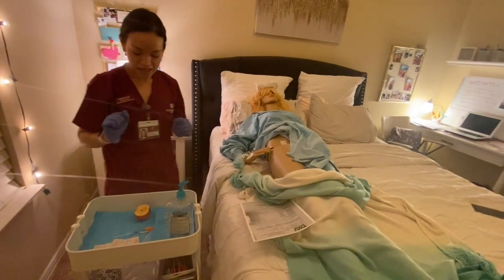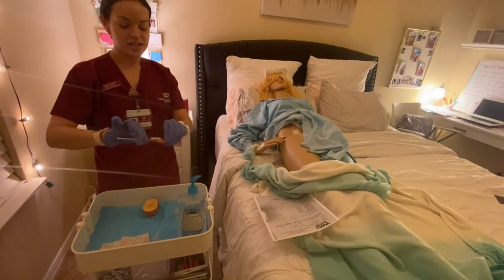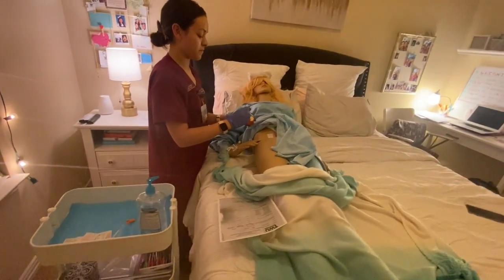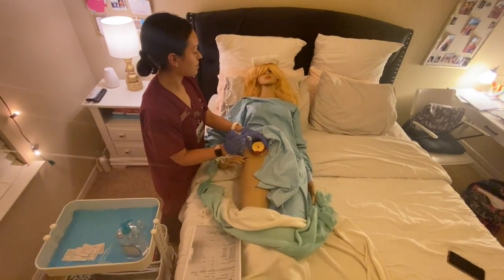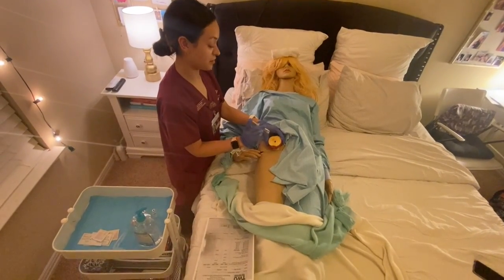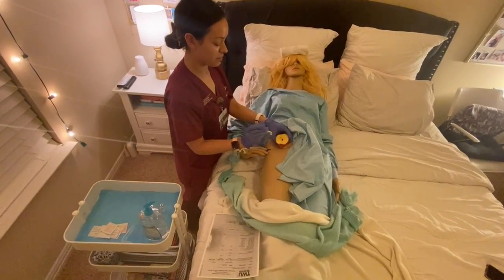So, okay, so now I'm going to open my syringe and I'm going to inject into her abdomen. Okay, Mrs. Winthrop, I'm going to insert the injection now, okay? Are you ready? Take a big deep breath, okay? Great job, awesome.